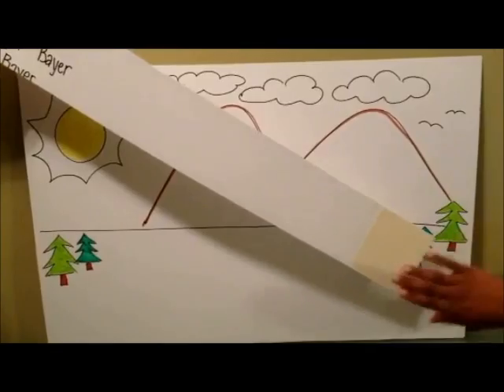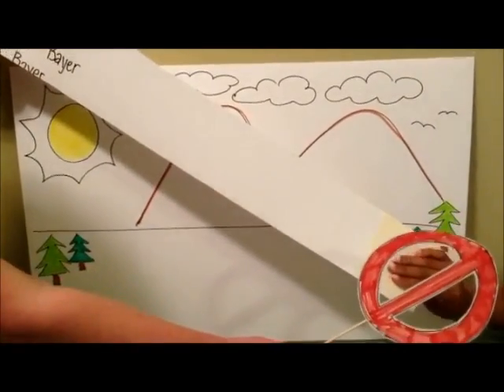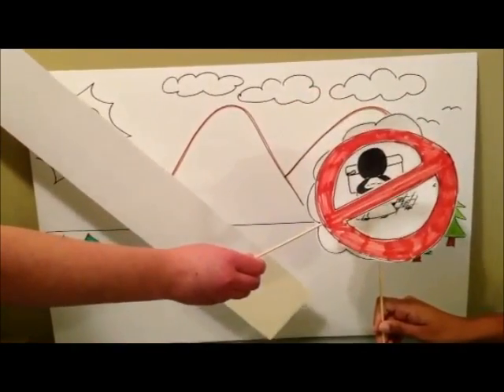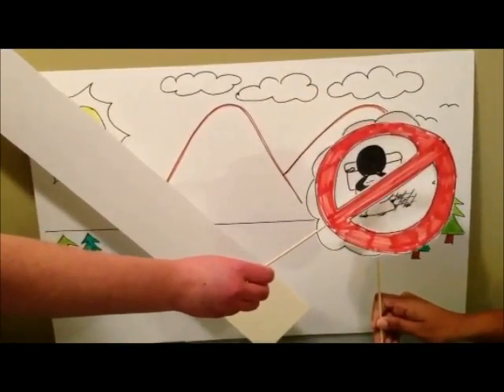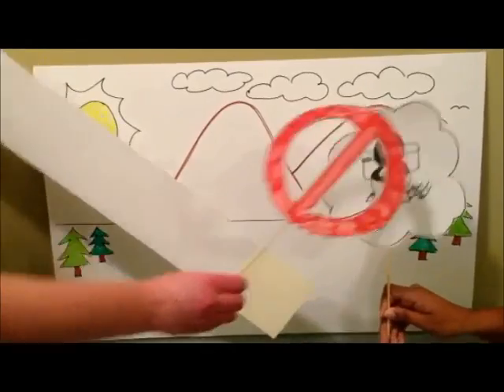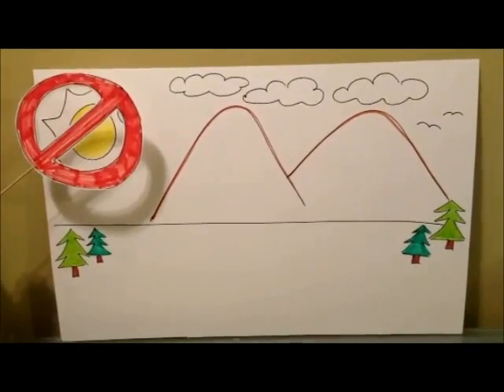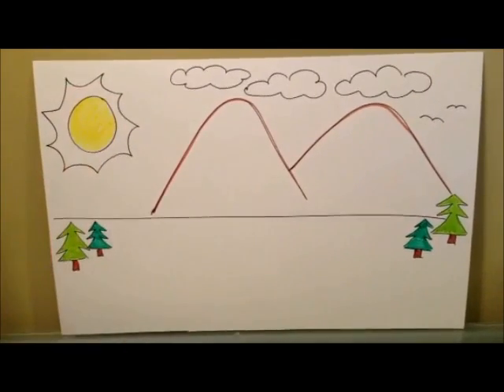Do not touch the test area portion of the strip or allow it to touch any surfaces. Do not dip the test strip into the toilet after urination, but instead use a clean, dry container to collect your urine sample. Do not store the strips near moisture, direct sunlight, or heat, and also do not remove the white desiccant packet from the bottle.